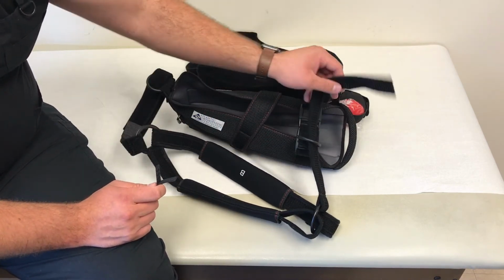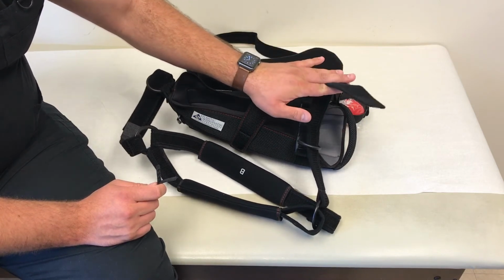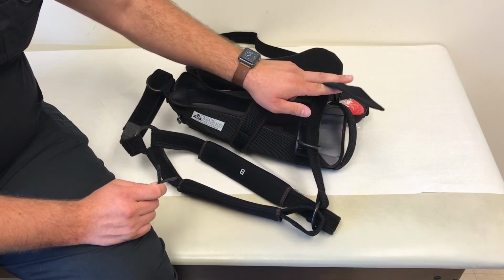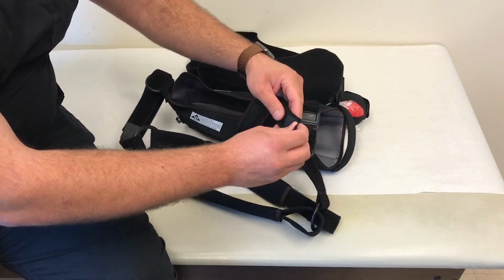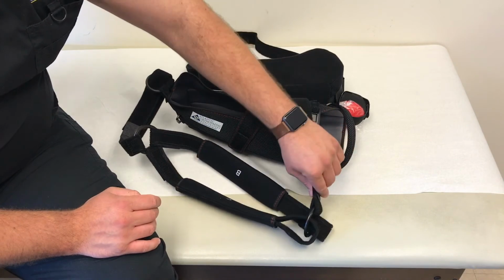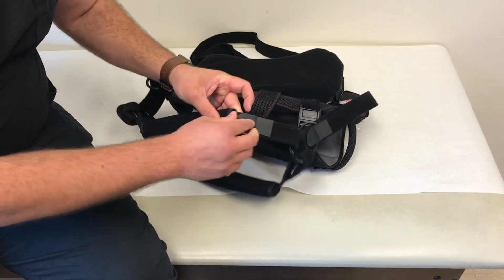Once you do that and you have a ton of strap left, you are okay to go ahead and clip the remaining amount of sling strap and then reapply the alligator Velcro to the end of it, just like that. And you can do that with all straps. All straps have the alligator Velcro.